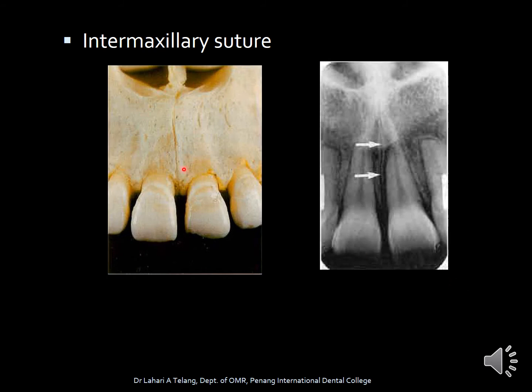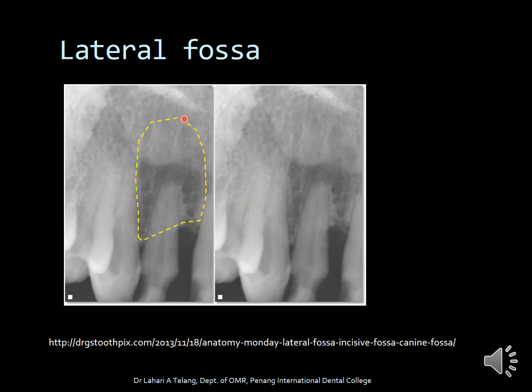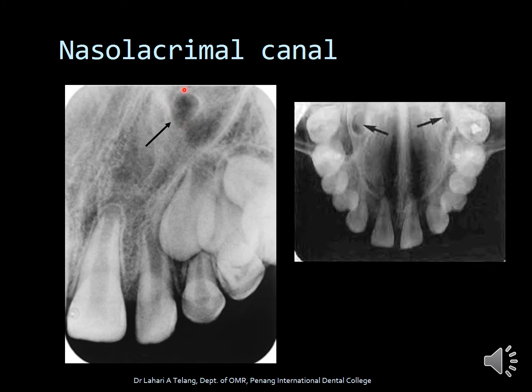The intermaxillary suture is where the two halves of the maxilla join in the center, and it appears as a radiolucent line on the anterior maxillary radiograph. The lateral fossa is a small depression seen in the lateral incisor area, generally visible because there is less density of bone near the lateral incisor, making it appear as a fossa. The nasolacrimal canal is very rarely seen on a canine radiograph but is highly placed and clearly evident on the occlusal view.